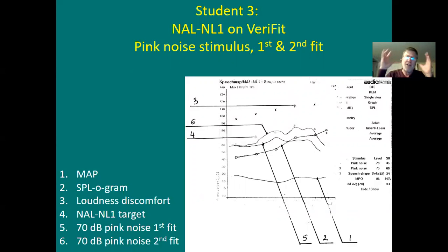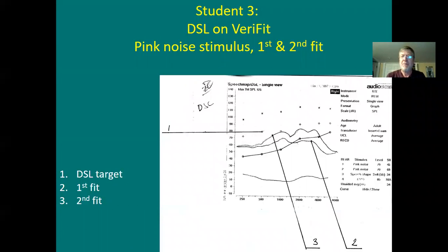Manufacturer software does its magic behind the screen, shows you a nice picture. Yep, you're hitting NAL1 targets just beautifully. Okay, let's prove it. Do real ear, and look at where you are. All right, you had to boost things up considerably to hit target. It's unreal. It's picture after picture after picture. Here's DSL-4 again. Look at where the targets are. See how they're halfway right between the floor and the ceiling?